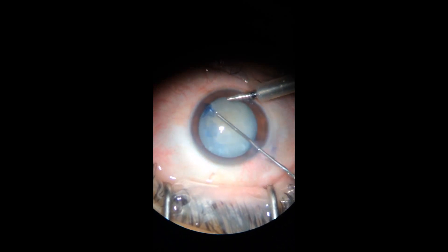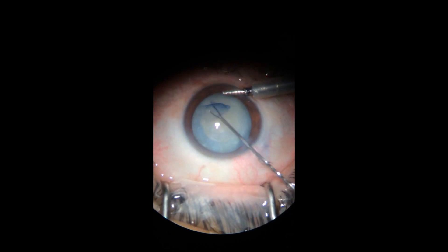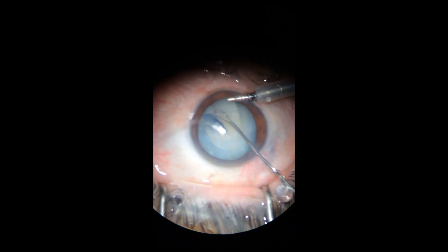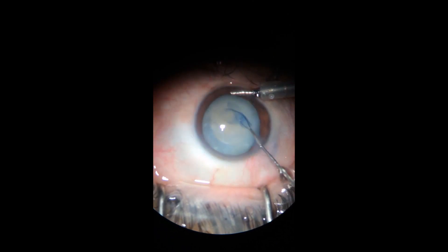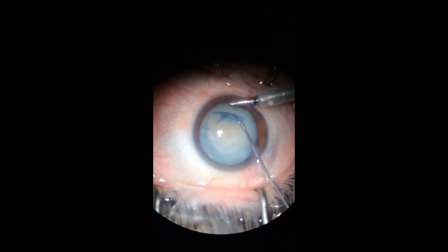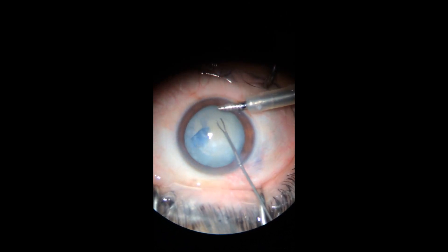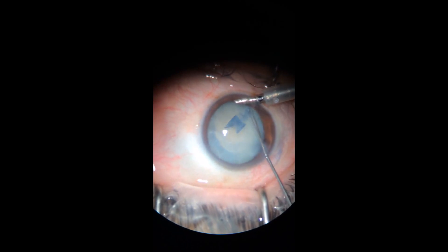Hello dear colleagues, what I will try to show you today is a case that I encountered — one of the operations that I've done: a cataract surgery on a 53-year-old woman that had an interesting feature.